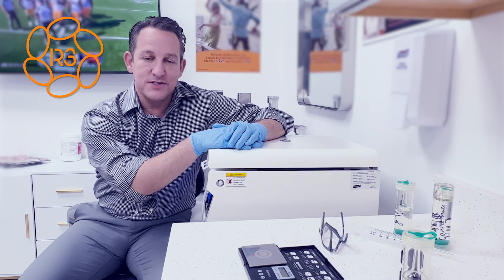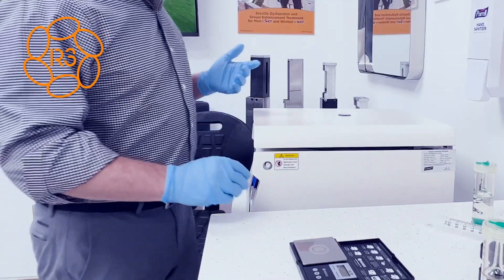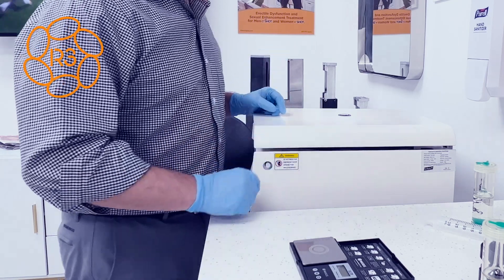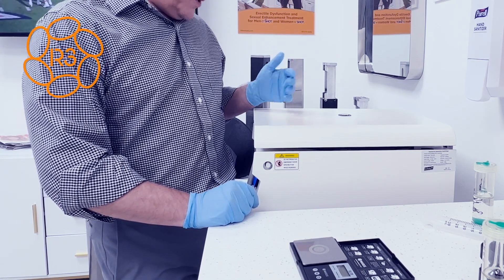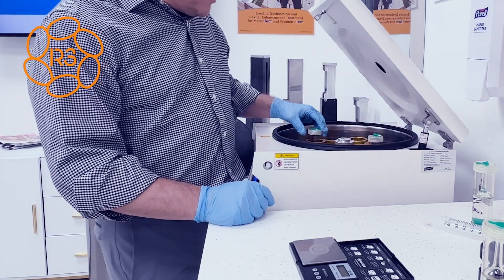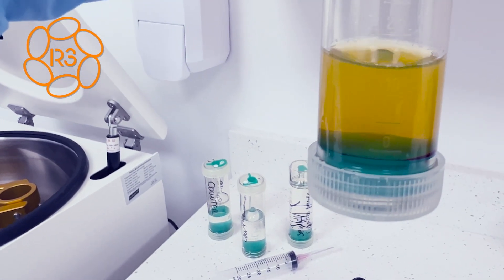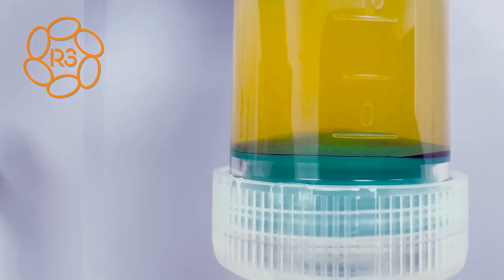Time is running down on this second spin. The second spin is pretty much done — this will open up in just a second and I'll show you what the PRP looks like. Why do we do a second spin? We do it to reduce the leukocyte count, the white blood cell count, so that it causes less pain and inflammation for patients. Here you go — you can see it looks very similar to when we put it in, but on the bottom, that's where there's a huge concentration of platelets.